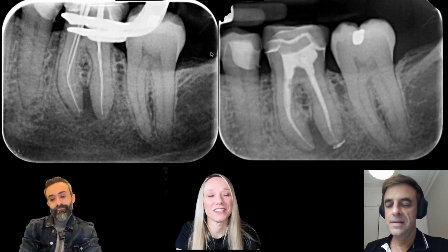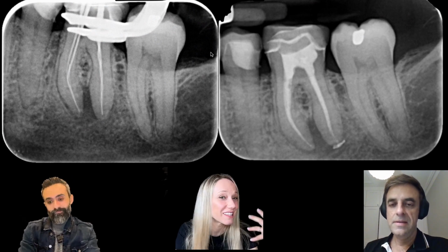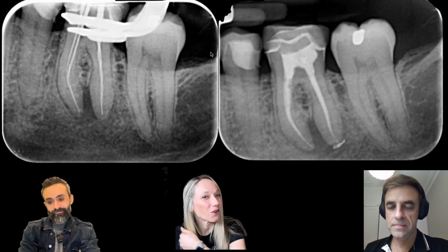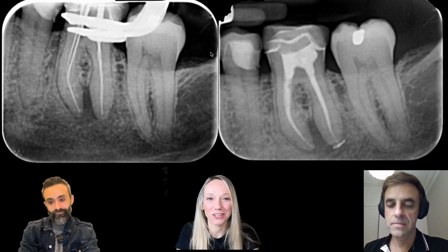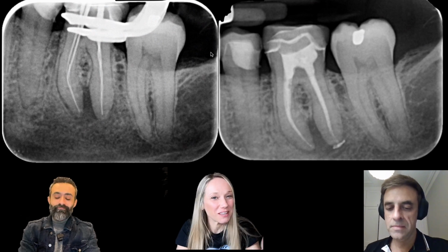So like 15 or 20 years ago, we didn't have them. So we relied on X-rays with the different angulation of the beam, etc.